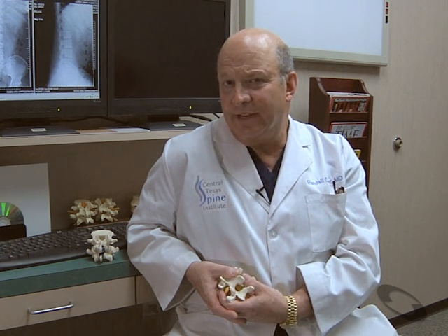The fusion rate with anterior-posterior surgeries of this type should be somewhere around 90% with good surgical technique. Autogenous bone graft off the iliac crest can be utilized. Of course, all of this is at the surgeon and patient's discretion, and FDA warnings and labeling should be observed.